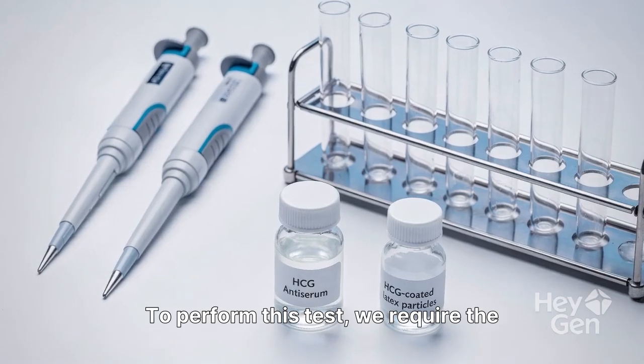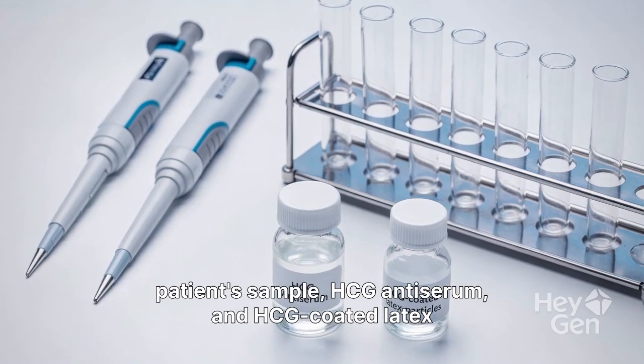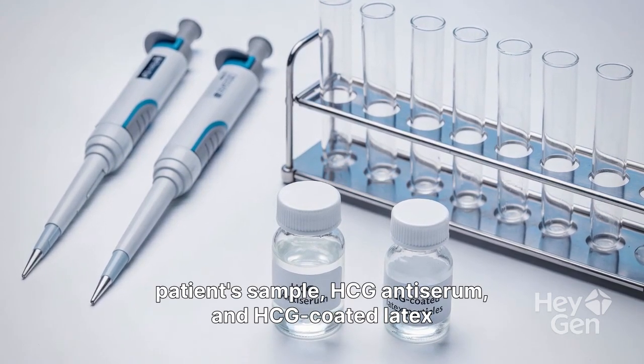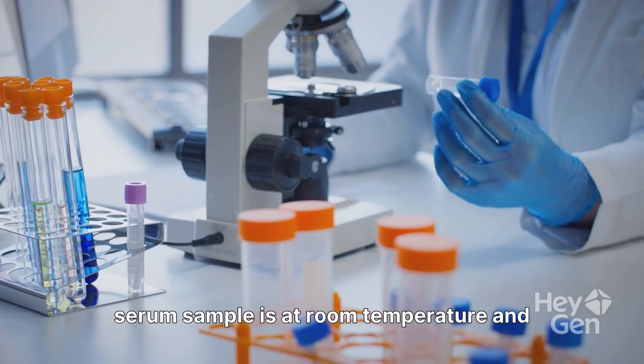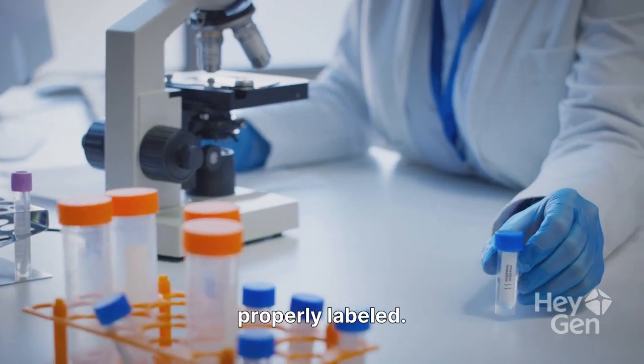To perform this test, we require the patient's sample, HCG antiserum, and HCG-coated latex particles. Begin by ensuring the patient's urine or serum sample is at room temperature and properly labeled.